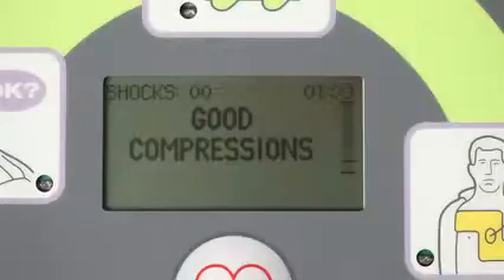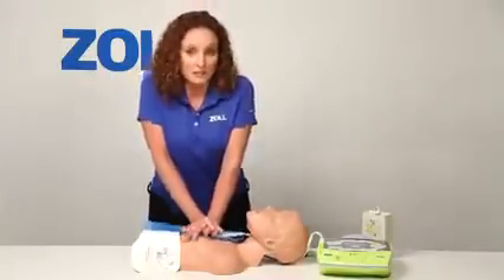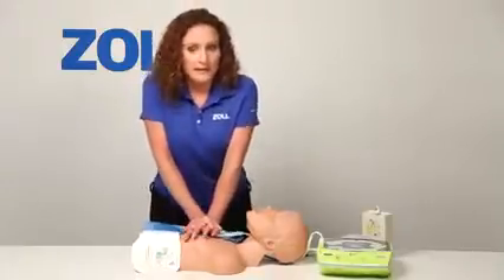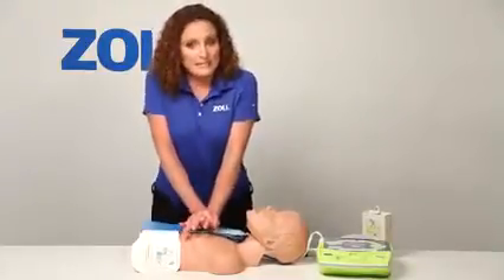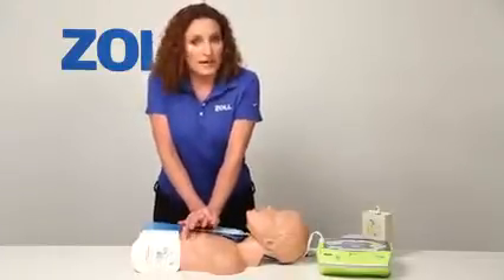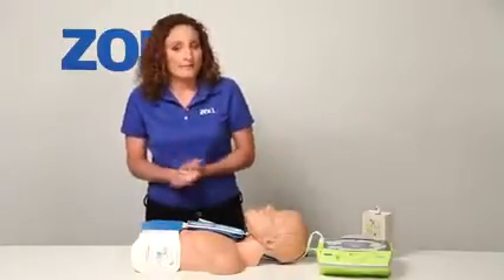Push harder — I'm not pushing hard enough. The beeps act as an adaptive metronome that monitors my compressions and tries to speed them up to at least 100 per minute. Good compressions. The 2010 American Heart Association guidelines for CPR recommend a compression-to-ventilation ratio of 30 to 2 for trained lay rescuers. Untrained lay rescuers can provide hands-only CPR. If you do stop compressions to give two breaths, the metronome stops.